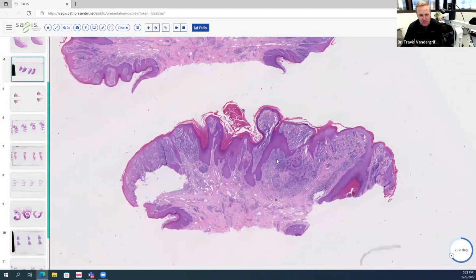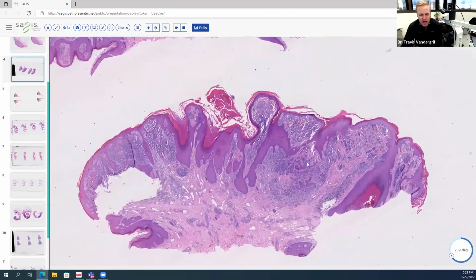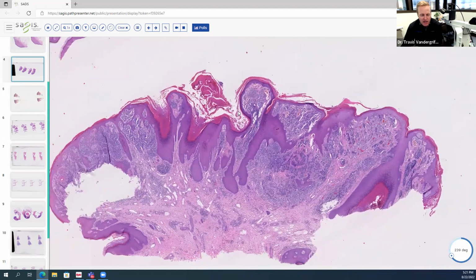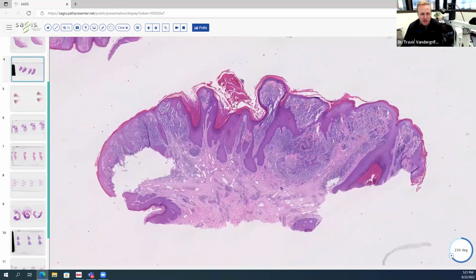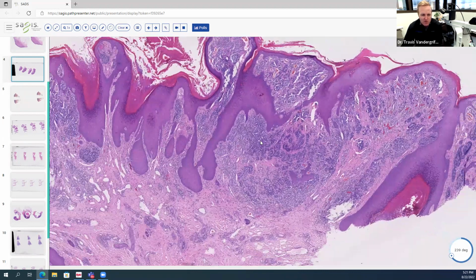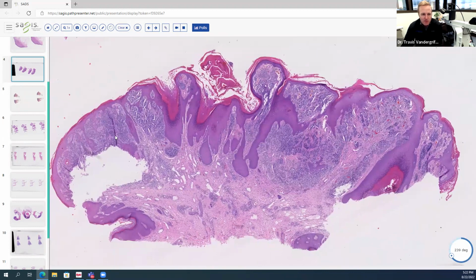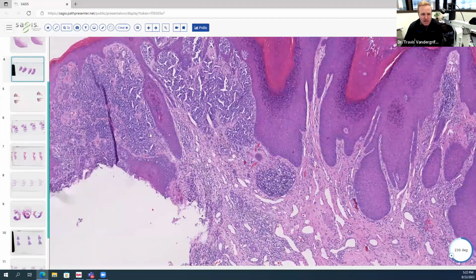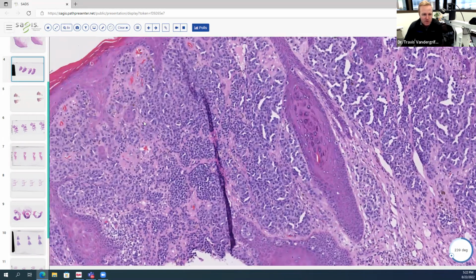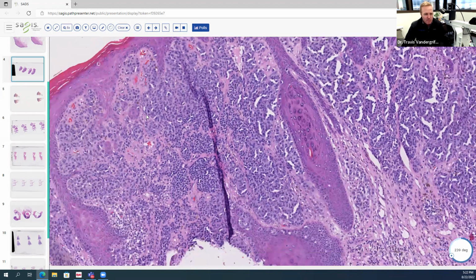And these diagnoses really kind of confirm that our final diagnosis requires an inspection of the neoplasm, not only from scanning, but from closer magnification as well. We make our first impression at scanning level with silhouette, but then we confirm and assess more closely by going into higher power views. So that is a nevoid melanoma.